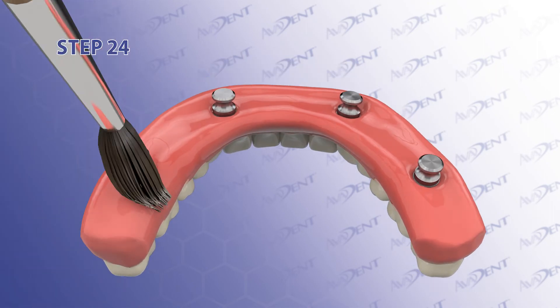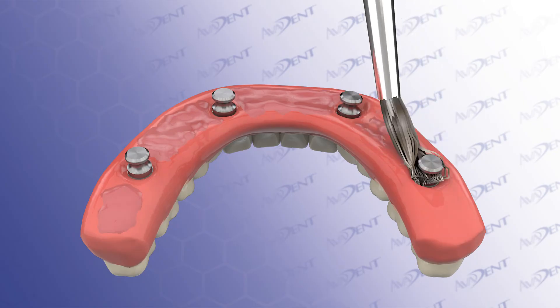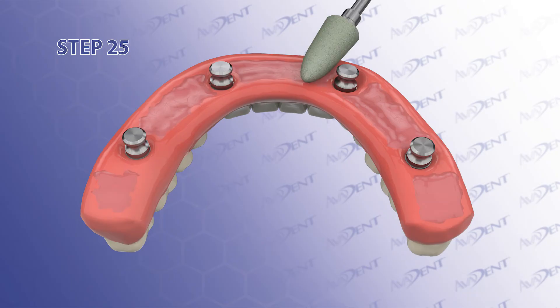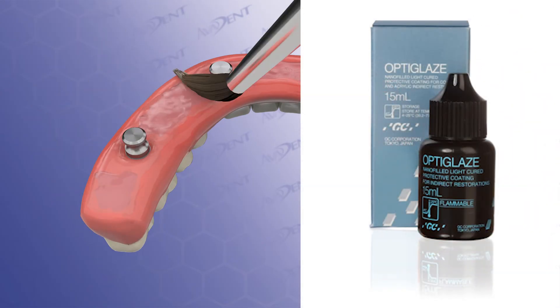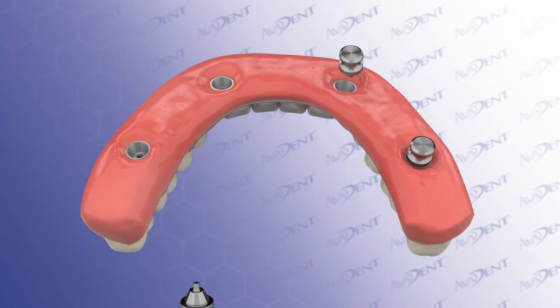Step 24. Add acrylic to the intaglio as necessary to eliminate concavities and optimize contours for home hygiene. Step 25. Polish the intaglio denture to at least a coarse finish. Apply OptiGlaze by GC America to all surfaces of the denture. Light cure in a curing unit for 2 minutes.